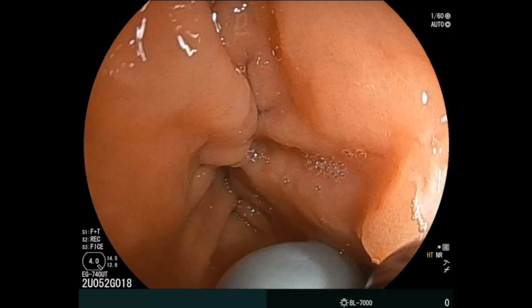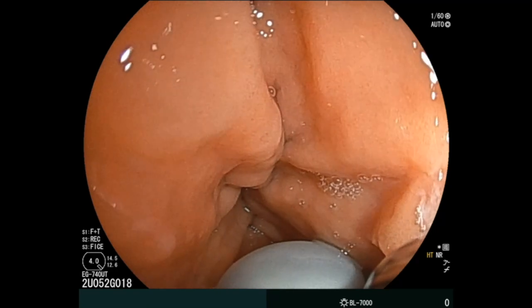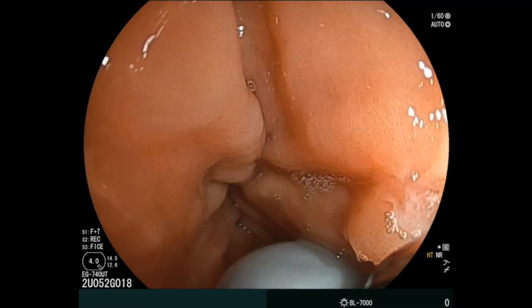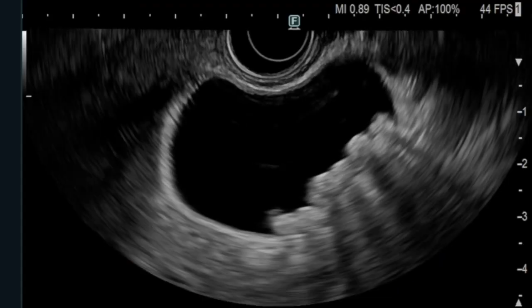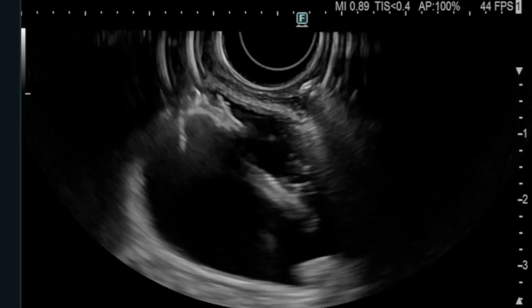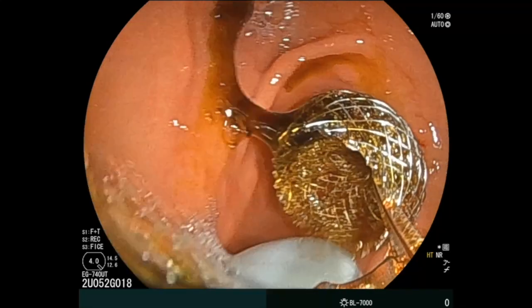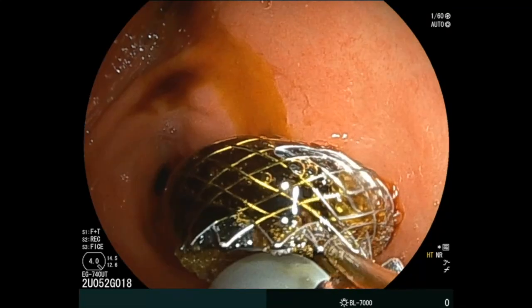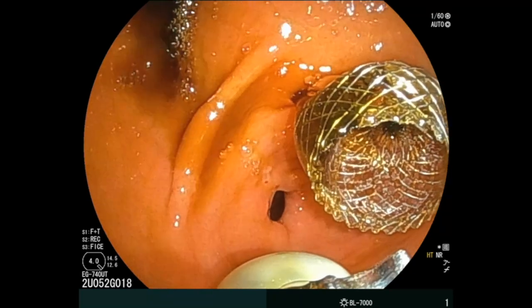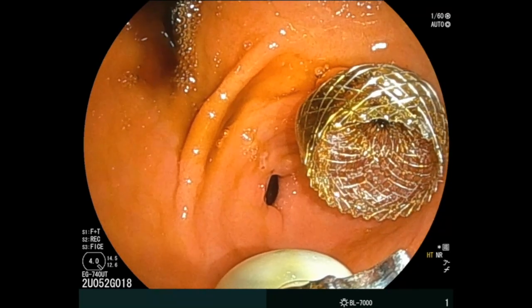In a 63-year-old non-surgical patient with acute cholecystitis, EUS-guided gallbladder drainage was attempted. An optimal site was identified in the gastric antrum to avoid placing the stent at the pyloric opening. Once the gallbladder was punctured and the distal flange of the stent was released, the proximal flange was released, and the uniquely designed forward-viewing optics of the EG740UT echoendoscope provided an unhindered view of the stent at deployment and post-deployment.